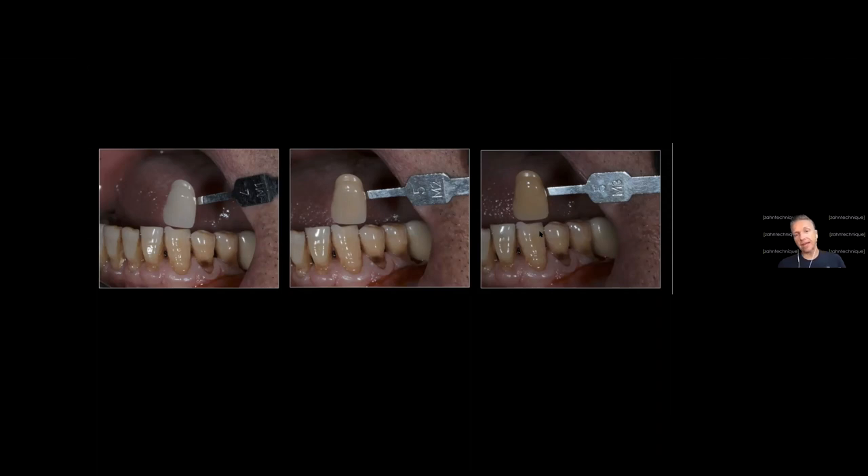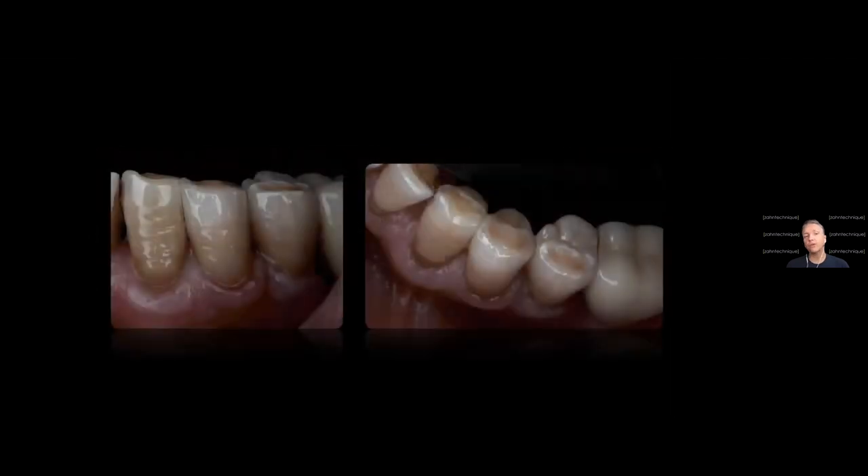That can even be darker — the 5M3 is one of the darkest on the 3D Master. Every position of the tooth and shade tab should be at the same angulation and same position — that is extremely important for consistency in color communication. That's how we finish a case nicely and aesthetically. By the way, this is a full-contour zirconia case — it can be aesthetic. But we won't go too deep into material selection today. That was a pretty straightforward shade, pretty straightforward case.